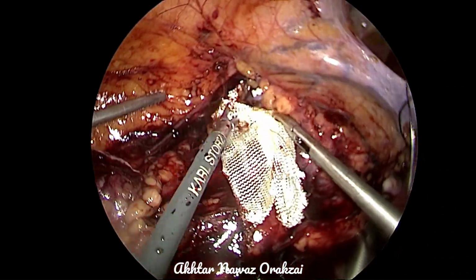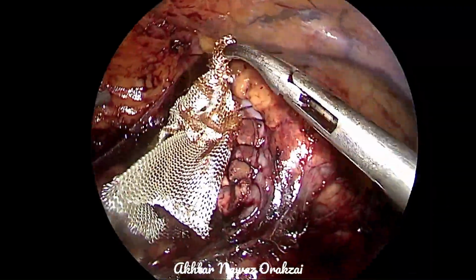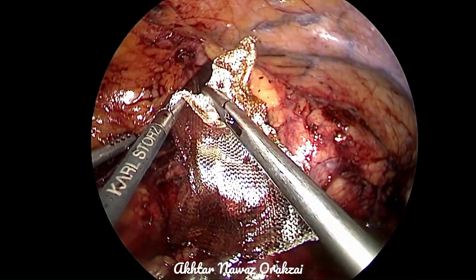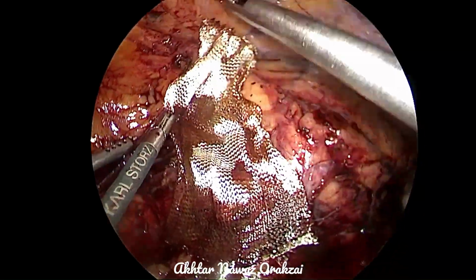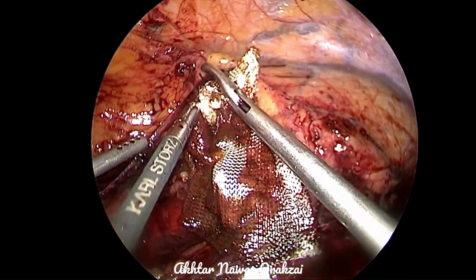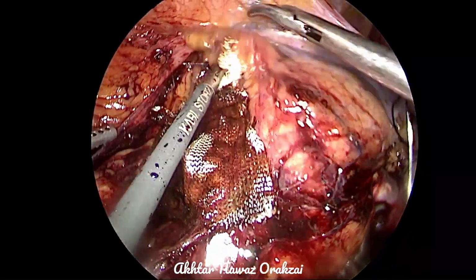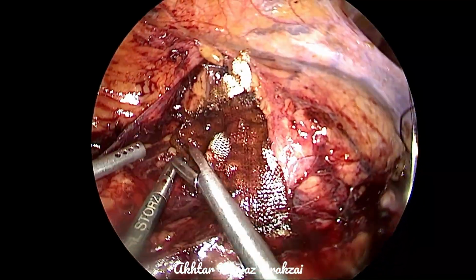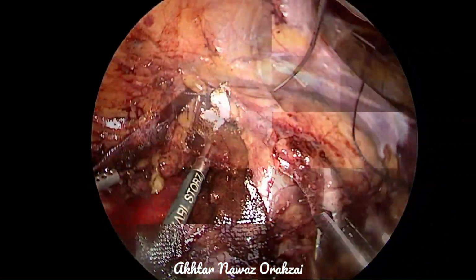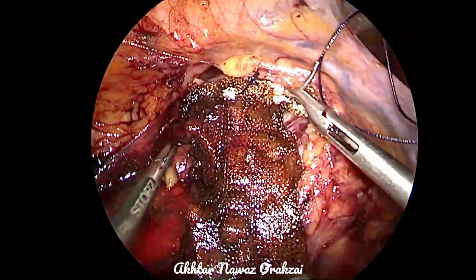So we apply Surgicel on the raw surface. Number one, it is covering the raw surface. Number two, it is also hemostatic. So a little bit of ooze coming from the cortex will hopefully be stopped by this Surgicel. We did not close the small rent in the calyx because it was too minor, and this suture will already cover that rent.